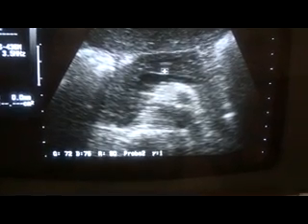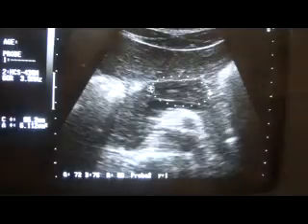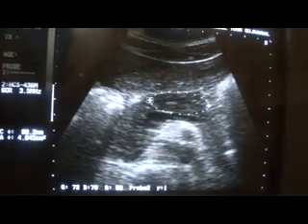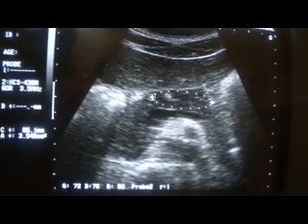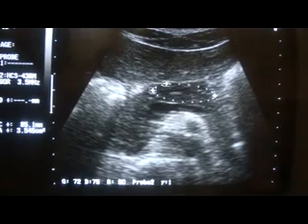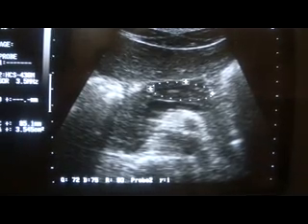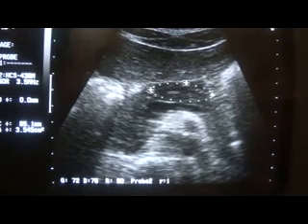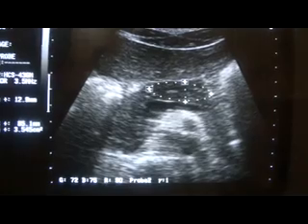This is the superior mesenteric artery arising from it, and this is the head of the pancreas in longitudinal section, which measures 3.6 centimeters by 1.5. The normal dimension of the head of the pancreas should not exceed 2.0 centimeters. So this is normal.